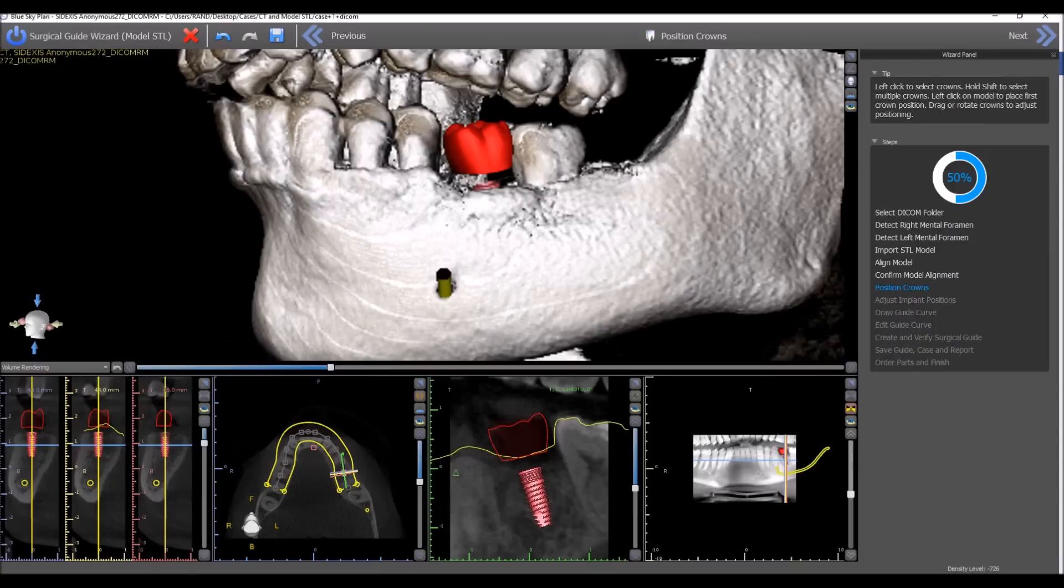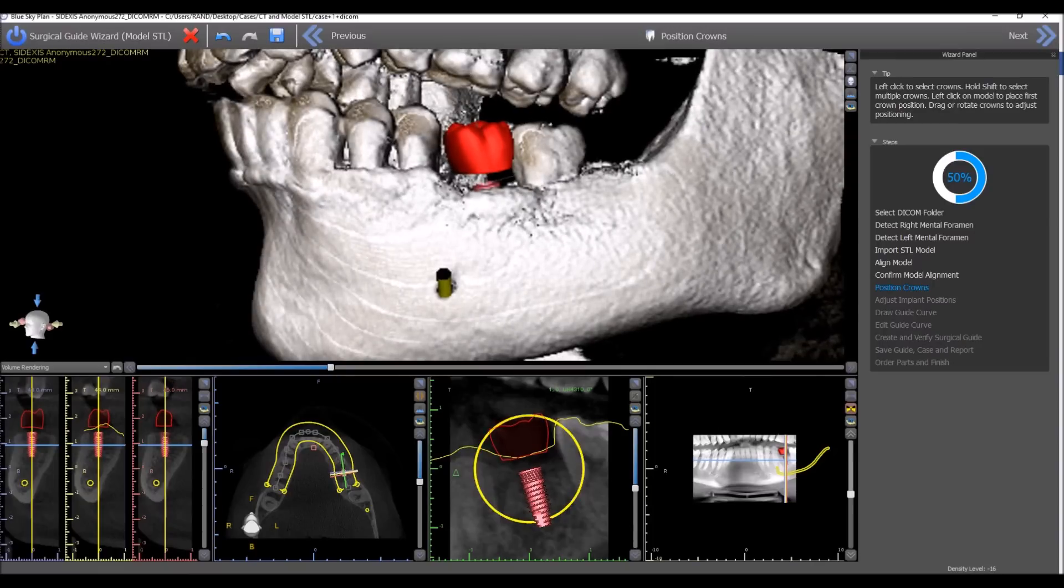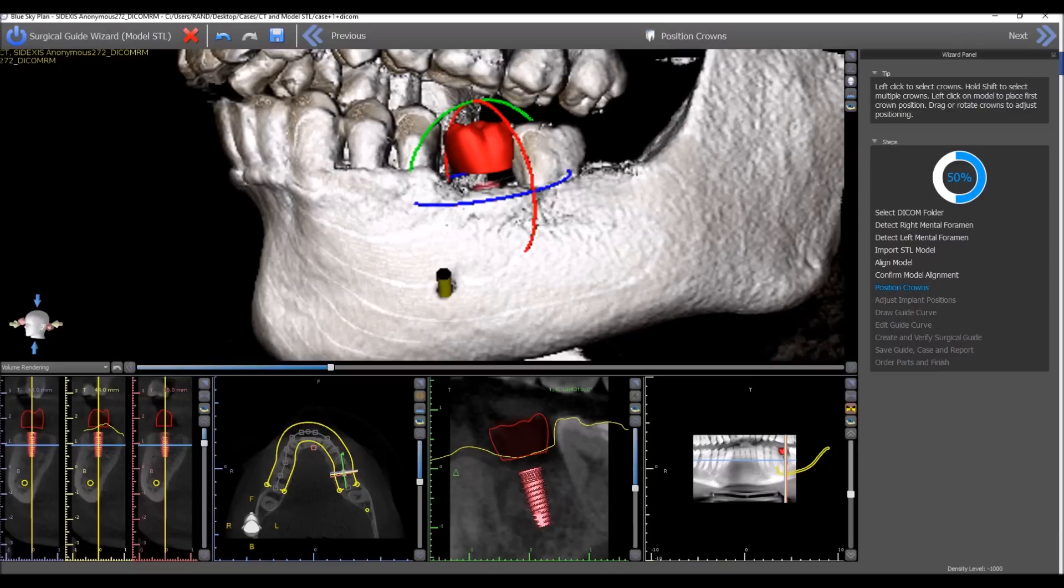Another improvement that was made to the software is that the widget circles have been made thinner. They're just as easy to grab, but you can see they take up less space, increasing visibility, both in the 2D views and in the 3D view as well.